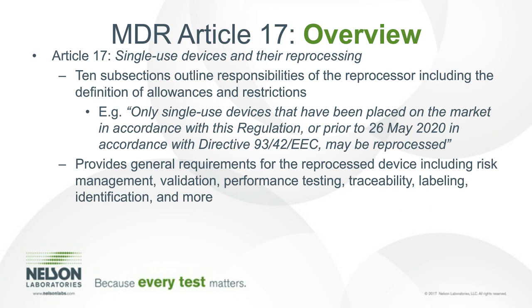Additionally, as expected, there are clauses relating to labeling, requiring that if the device is a single-use device that has been reprocessed, the label indicate the fact that it has been reprocessed, including the number of reprocessing cycles already performed and capturing any limitations to the number of reprocessing cycles.